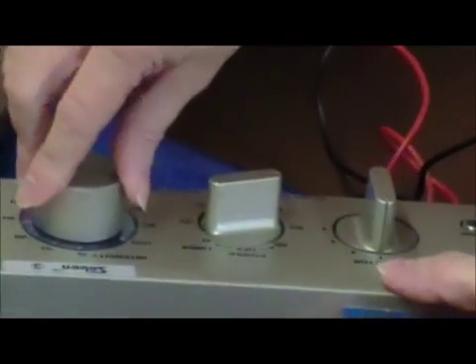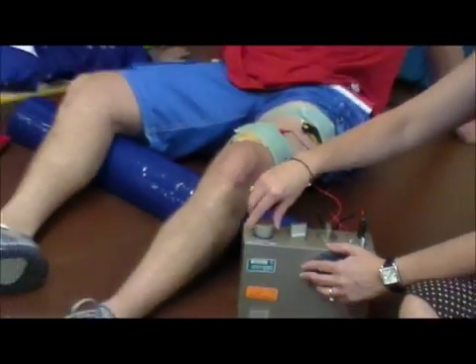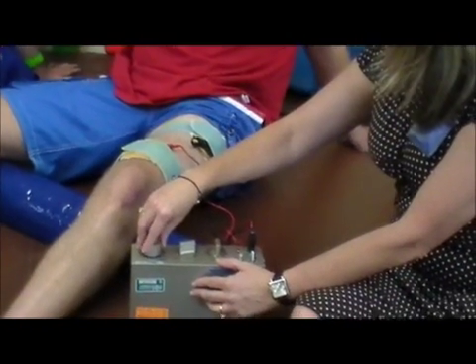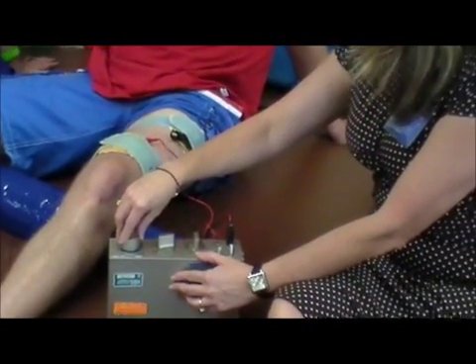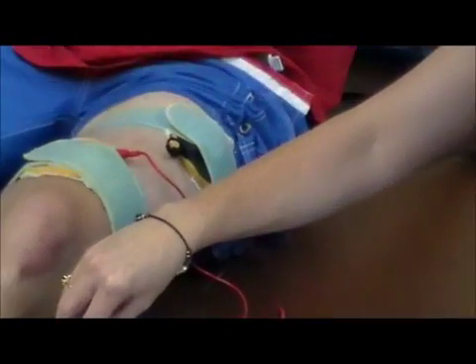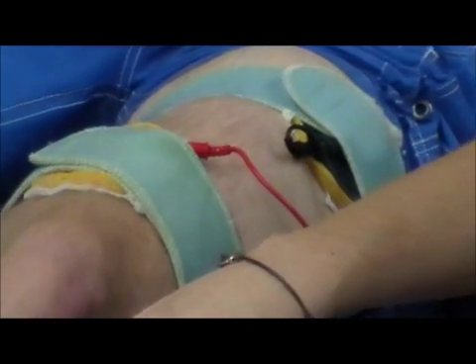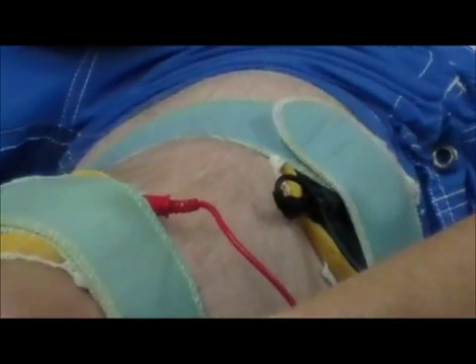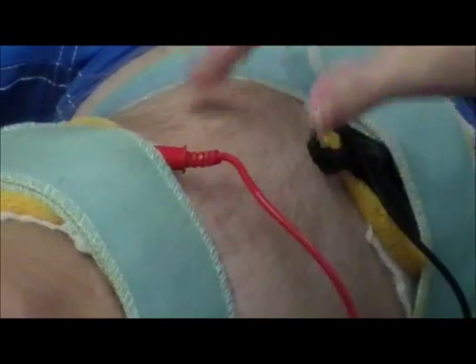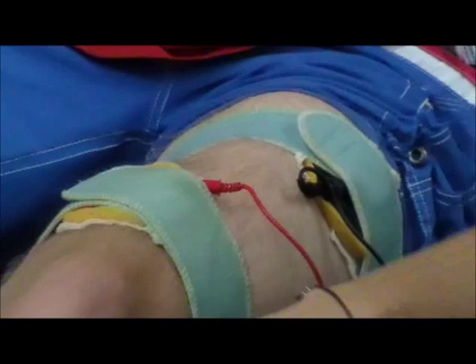Here we start turning it up. Tell me when you start to feel it. Now it's wiggling. I can see it. Is it wiggling? Okay, so this way, this way, this way. Yeah. Oh, wow. There it goes. Yep, I can see it. There we go. And it's just holding. Is it hard? Very hard. That's not contracted all the way.